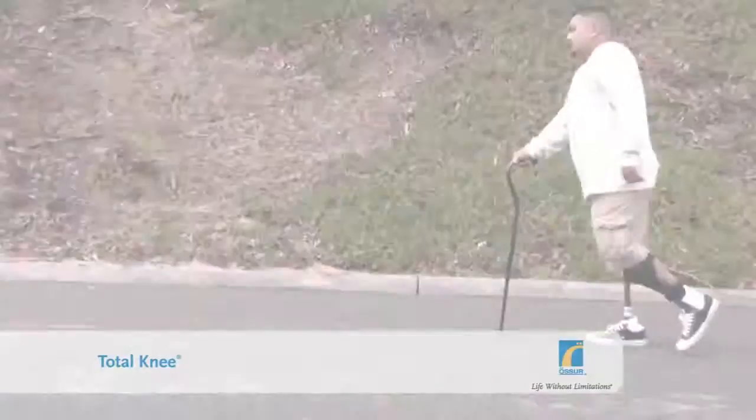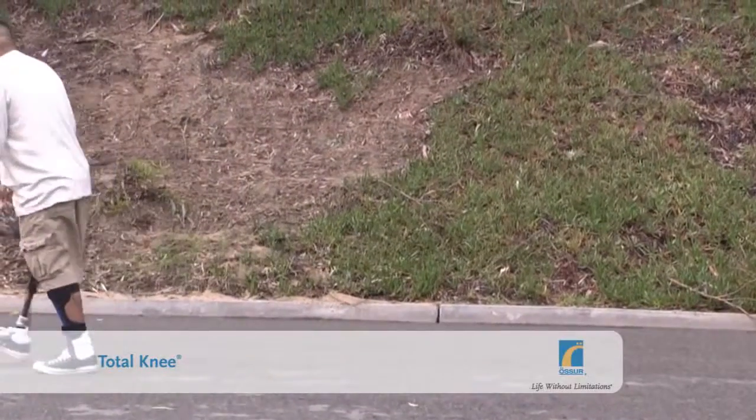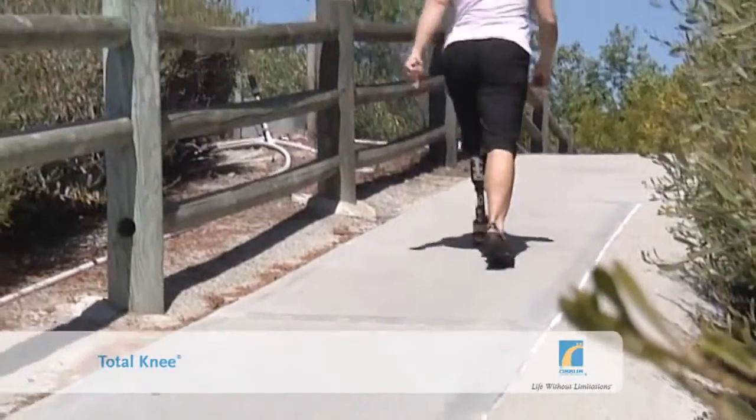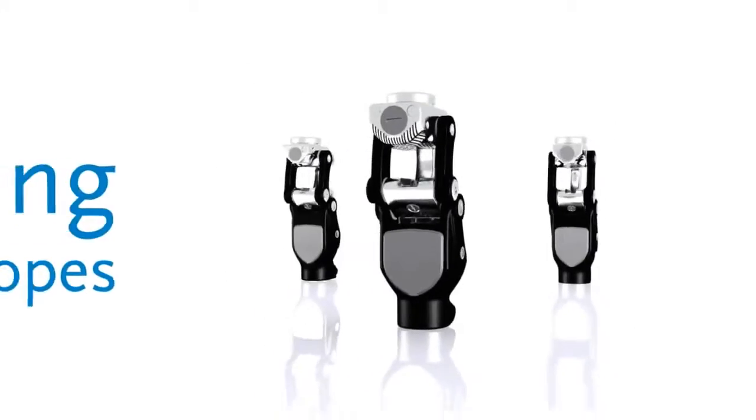The additional toe clearance provided by the shortening movement of the total knee when it is off the ground and swinging forward into the next step really helps to prevent the toe dragging on the slope as you walk up.